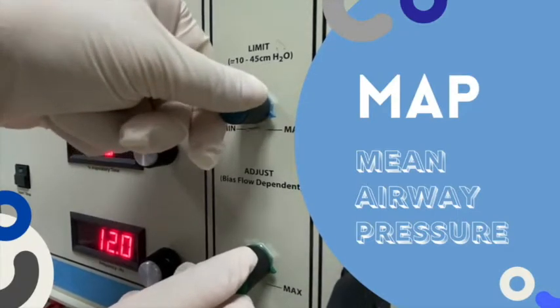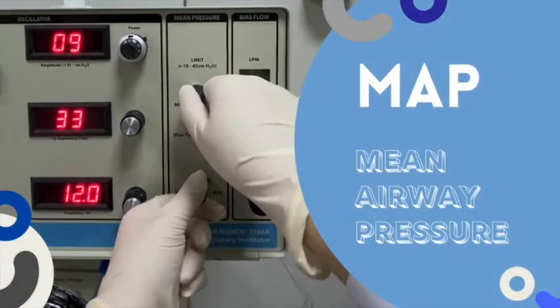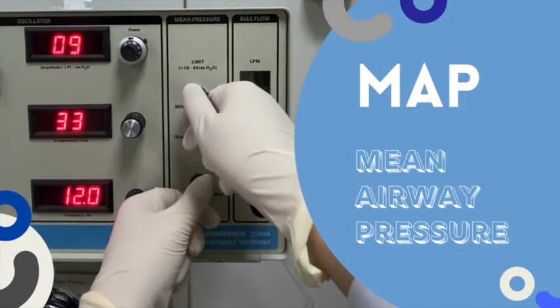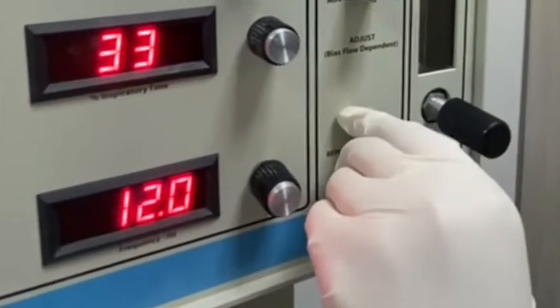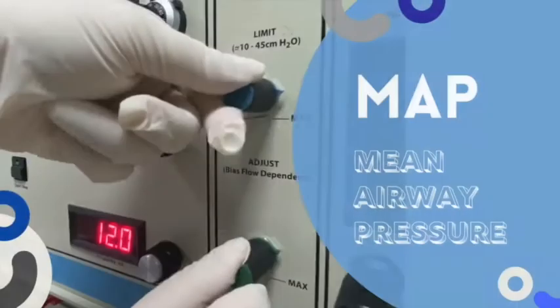Then adjust the MAP, which provides a constant distending pressure equivalent to CPAP. This will inflate the lung to a constant and optimal lung volume, maximizing the area for gas exchange and preventing alveolar collapse in the expiratory phase.